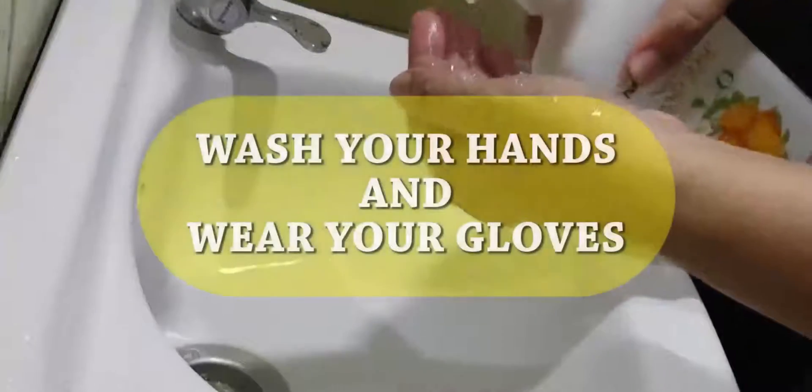Before doing the specimen collection, make sure to wash your hands and wear your gloves to protect you from contamination.